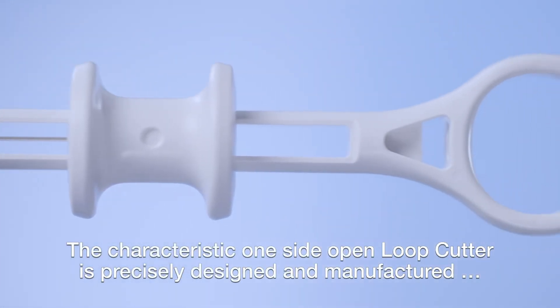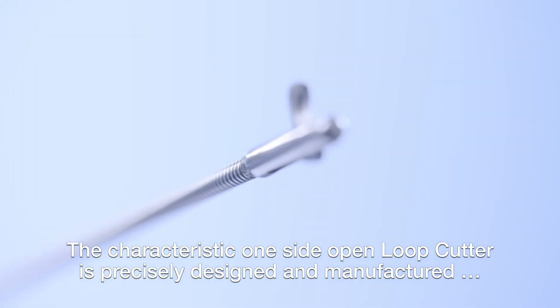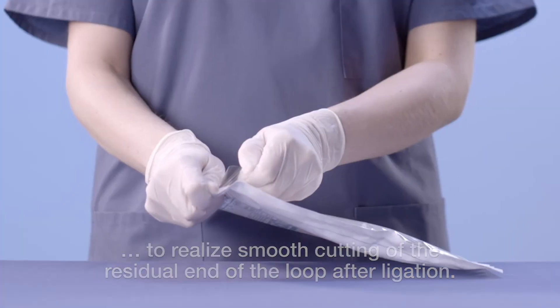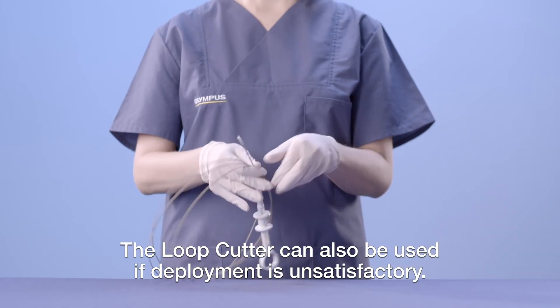The characteristic one-side open loop cutter is precisely designed and manufactured to realize smooth cutting of the residual end of the loop after ligation. The loop cutter can also be used if deployment is unsatisfactory.